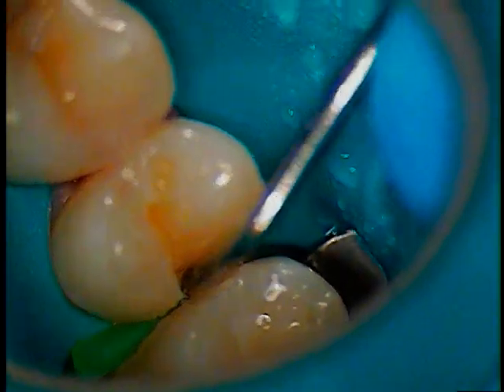And if I dry this off, I'll show you where I'm going to place my bonding light. Bonding light, small tip, it's going to go right here. Okay, and I'm not going to fill all of just the base of this. Now see, it's a little tight still. Do we have anything smaller than this? I'm just going to polish that a little bit. See all that white, and then there's brown up next to it into the dentin.